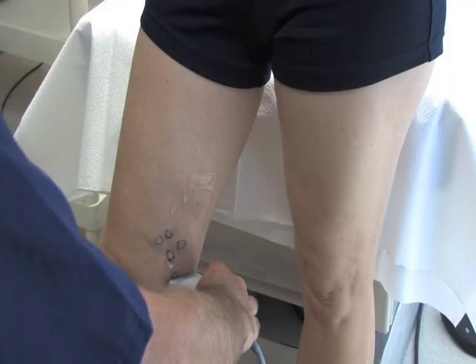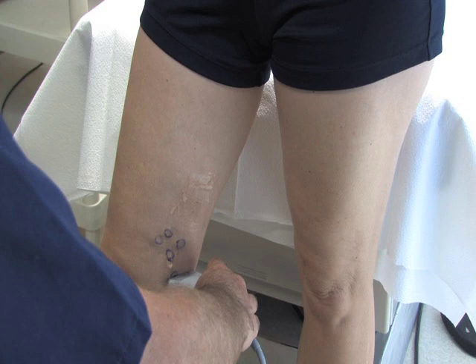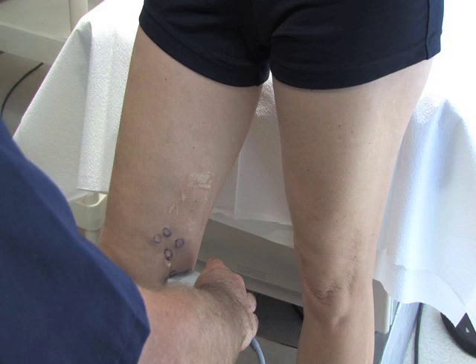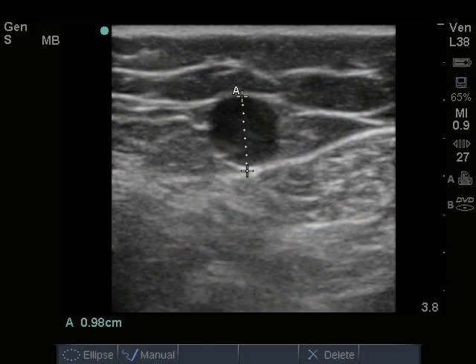An alternative approach can be performed where the transducer is placed along the medial aspect of the knee and the vein is followed proximally towards the head. Normal greater saphenous vein diameter is less than or equal to 0.3 centimeters.